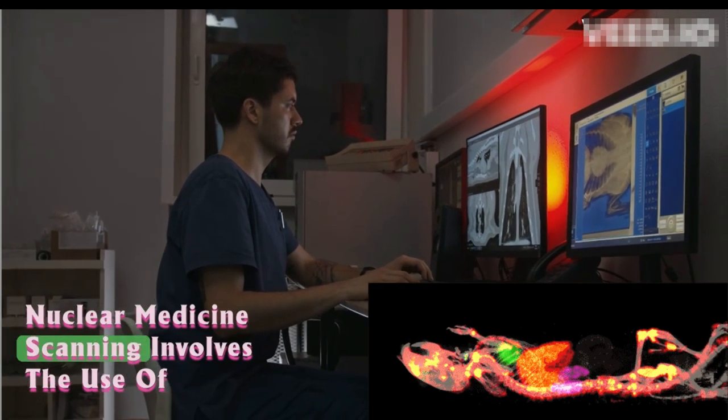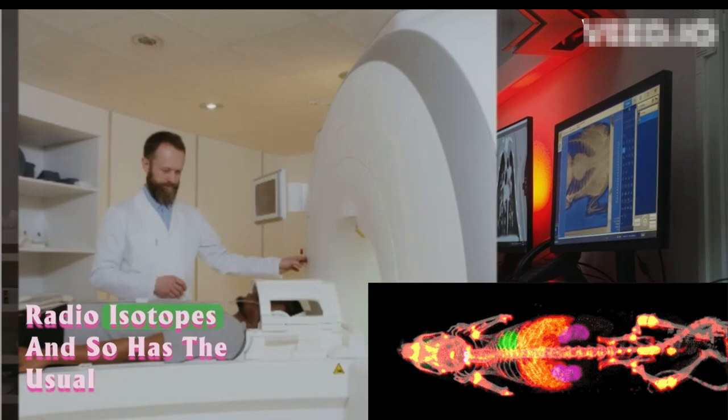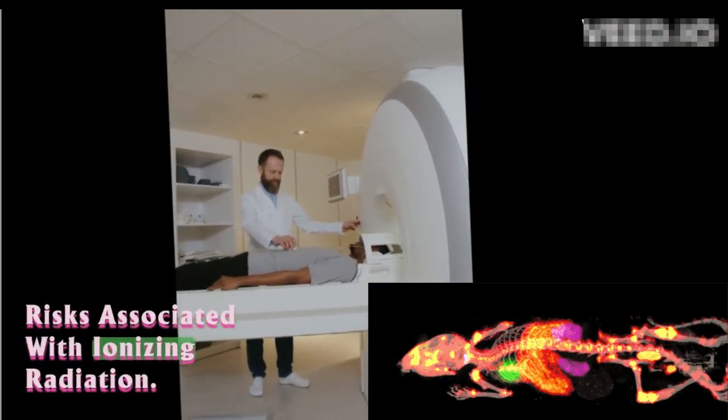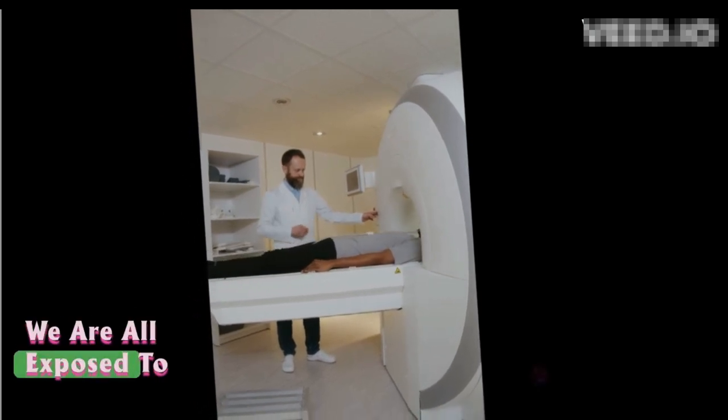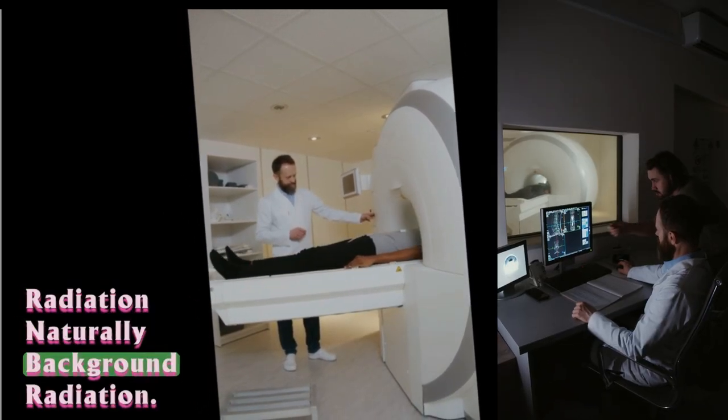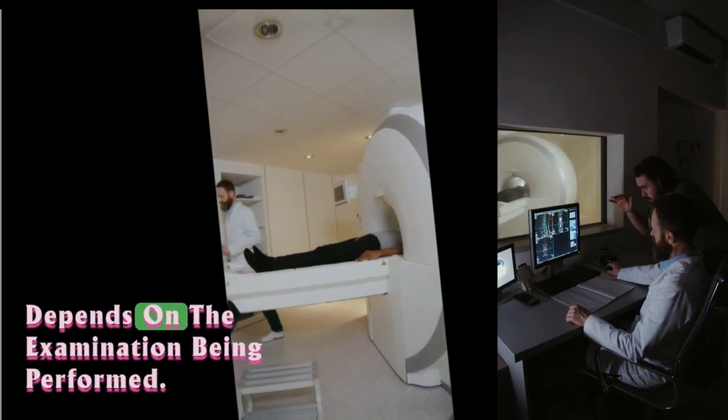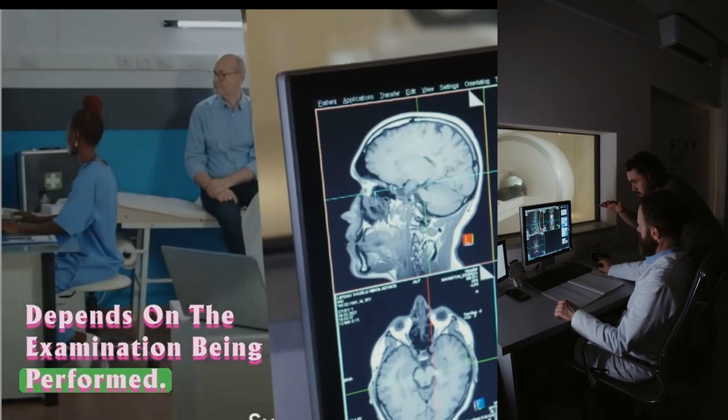Are there any risks? Nuclear medicine scanning involves the use of radioisotopes and so has the usual risks associated with ionizing radiation. We are all exposed to radiation naturally (background radiation). The amount of radiation you receive depends on the examination being performed.